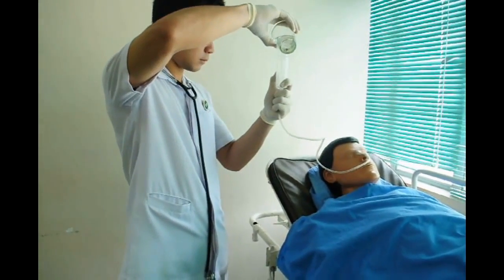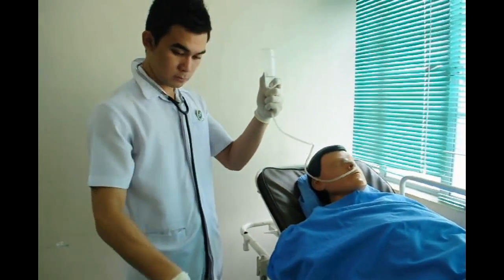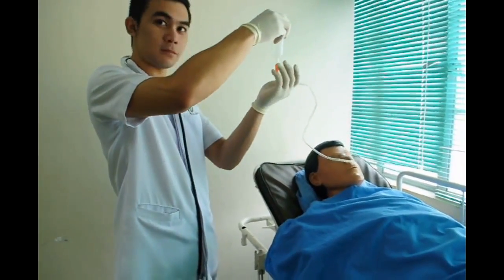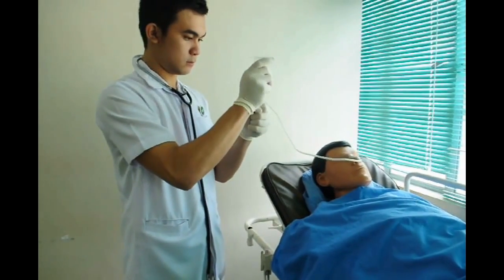If the residue is less after aspiration, then proceed to flushing. Flush the tube with 30 ml of water for irrigation. This is to keep the tube patent. Disconnect the syringe from the tubing and cap the end of the tubing while preparing the formula feeding equipment.